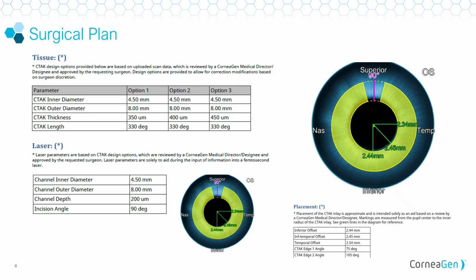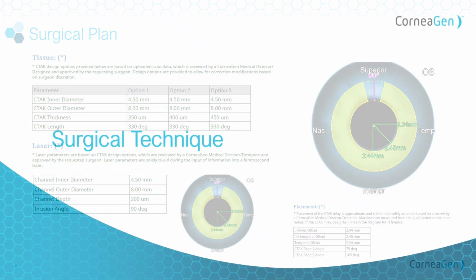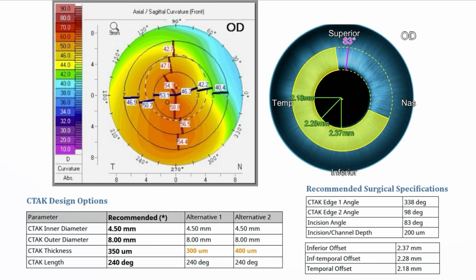Great, so now let's talk about day of surgery, surgical technique, how this is going to look. And what I'm going to do is take us through a case here to put it to life, so to speak. Here's a patient with moderate keratoconus, right?